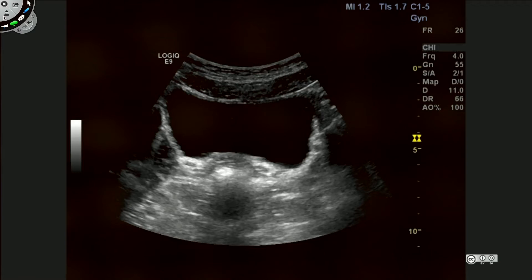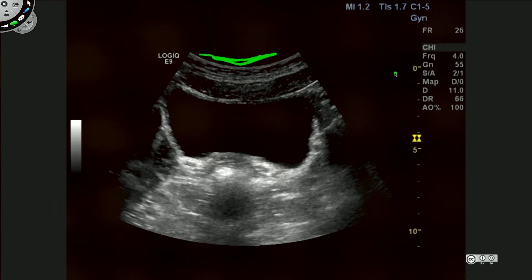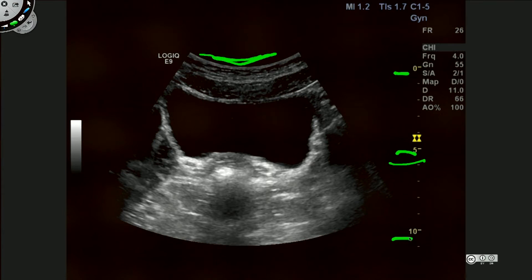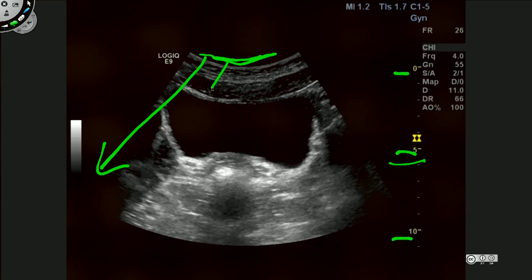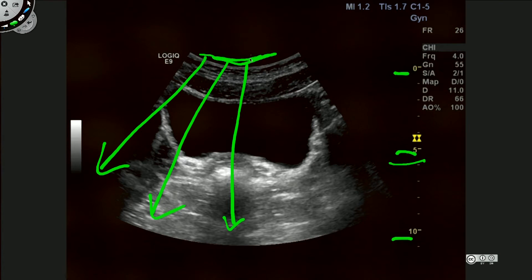Consider this example of a distended urinary bladder. What we can see on this screen is the transducer anteriorly on the pelvic wall, and along this graduation here is the depth of tissue. So at this point we are 5cm below the skin surface, and at this point we are 10cm below the skin surface. As the ultrasound beam fans out, it follows the shape of the transducer head. As the ultrasound beam comes down, part of it is then reflected and goes back up to the transducer to produce our signal.